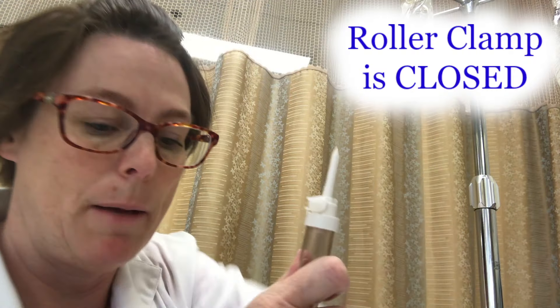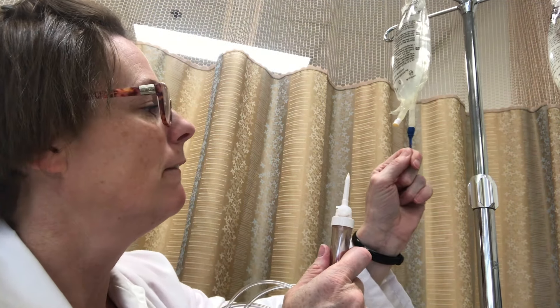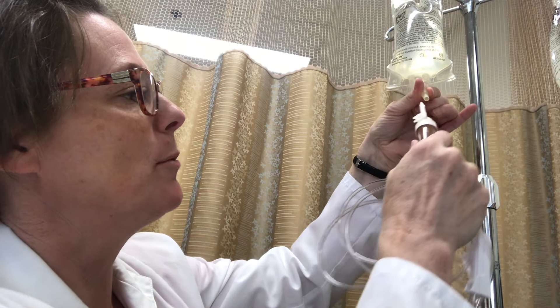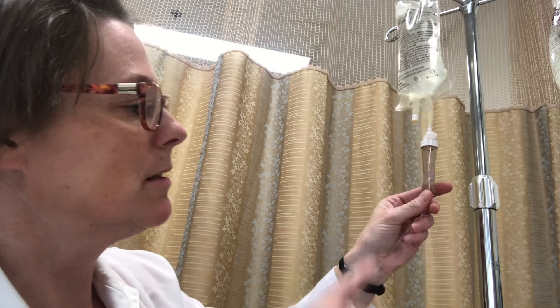We're going to take off the catheter cap now — my sterile tip is exposed so I don't want that to touch anything. I'm also going to pull off the blue sheath, discard it, securely hold the spike between my thumb and index finger, and insert my sterile tip into the bag. We're going to give it a squeeze and get some fluid into the drip chamber. Now I can manage the flow all the way down to the male luer.